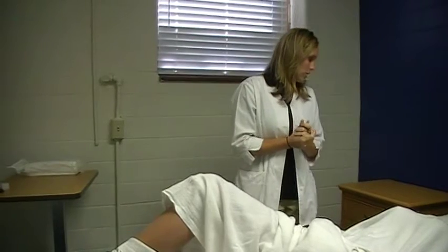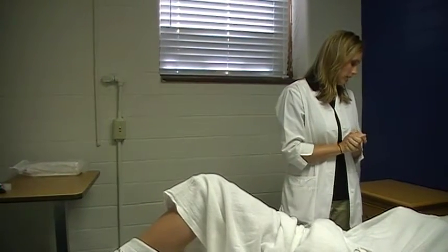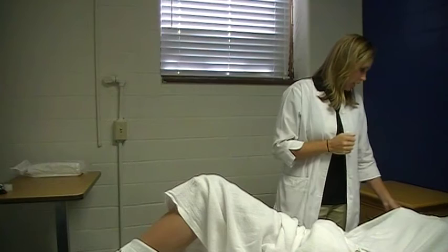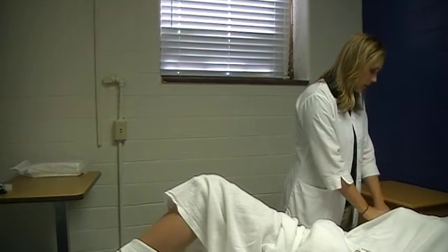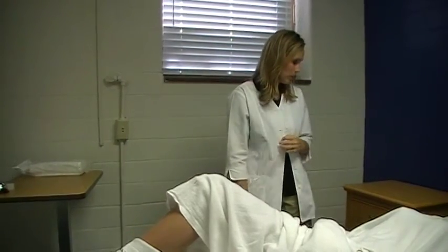Now we're going to get ready to go sterile. The lab manual says to stand on your dominant hand side — I'm right-handed so I'll stand on the patient's right side. It's much easier to use your dominant hand to maintain sterile technique effectively. Then we're going to open our packaging using sterile technique.